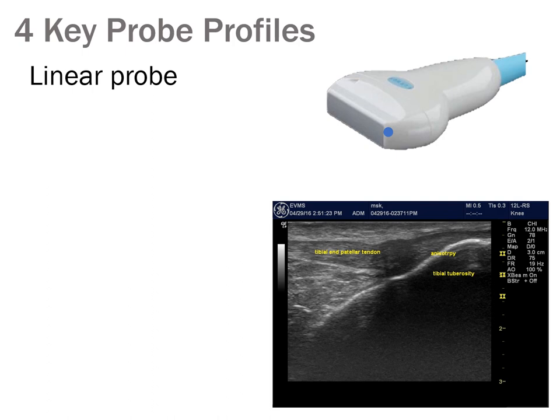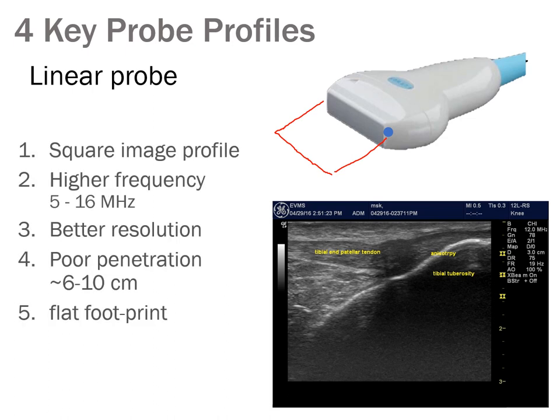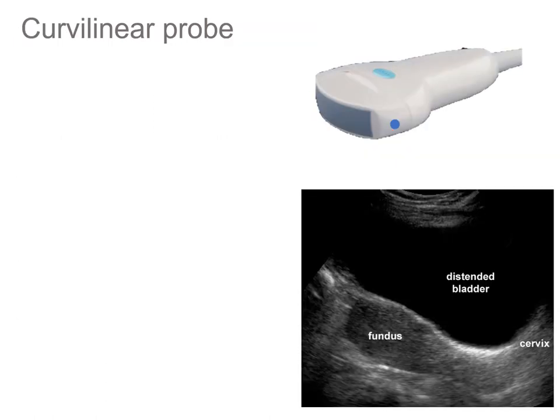When we think about the probe profiles that we'll be using, you should be familiar with probably 3 to 4 of these key probes that are used in ultrasound. The linear probe: notice how the image has a square profile because the probe would shoot straight out and produce an image that matches the square profile. This is a linear probe. It has a high frequency, up to 16 megahertz for this particular probe, which will give us better resolution, but will not give us as good of penetration. It has a nice flat footprint, but that means that it's not very good for very bony objects in some places because it loses a signal.